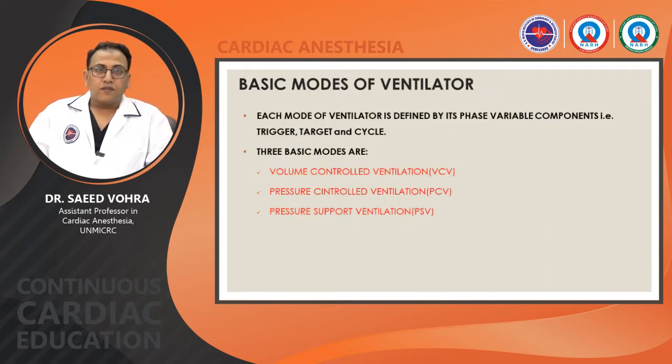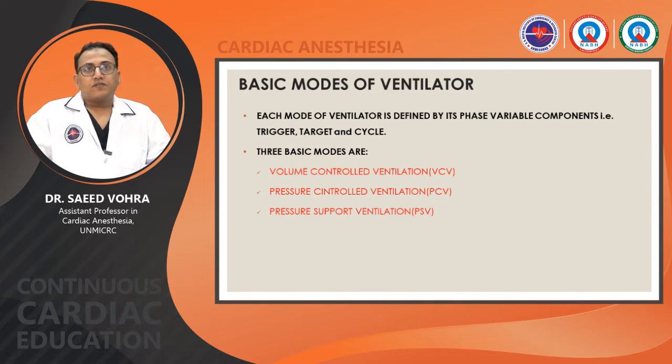Basic modes of ventilation. These are the three basic modes determined by the phase variables. From these three basic modes, we have many other modes which are covered separately in a different seminar. Volume control ventilation, pressure control ventilation, and pressure support ventilation.